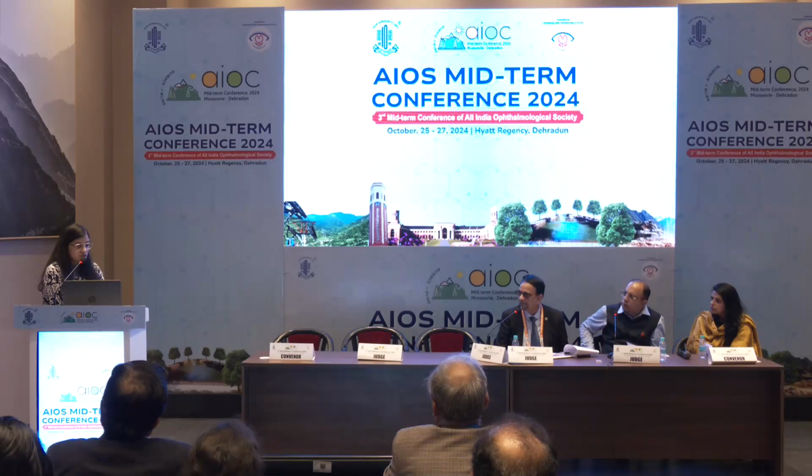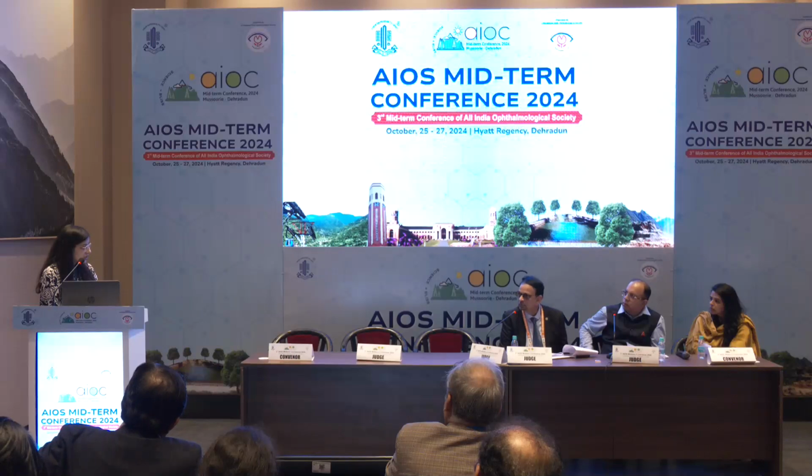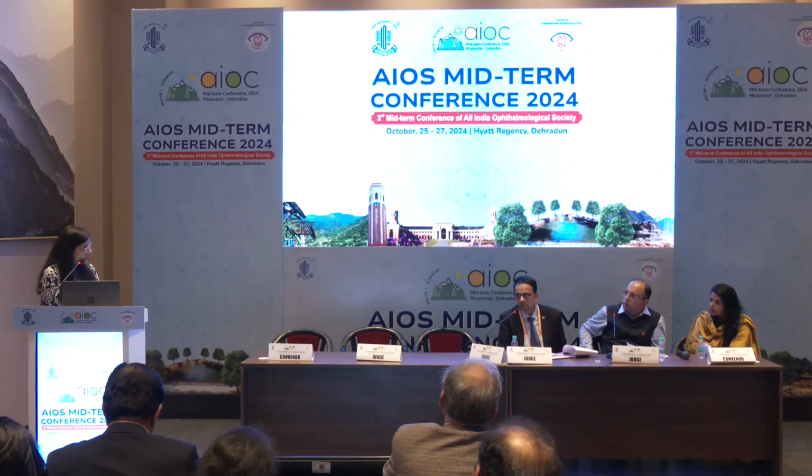Yes, sir. In this particular case, there was no pupillary capture, because this patient has a maximum dilation of 5.5 only, and the IOL was very stuck to the back side of the iris. We have done only 2 cases, and in those cases we have not observed it. However, in a case where there is more dilation, there might be a chance of pupillary capture. There's a possibility.